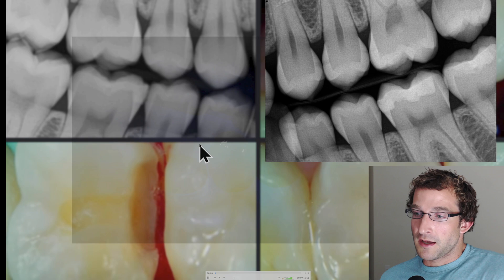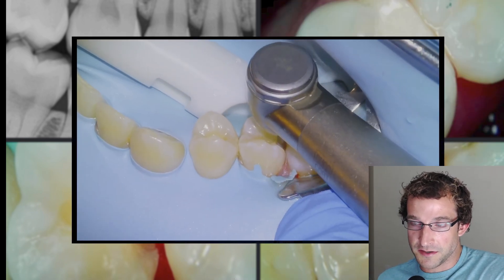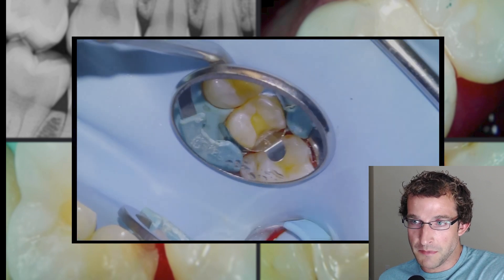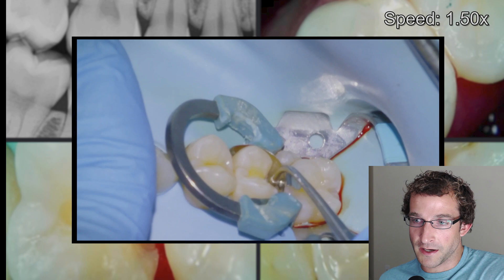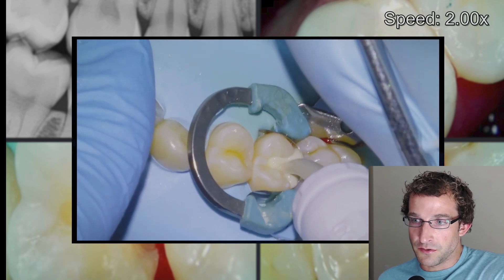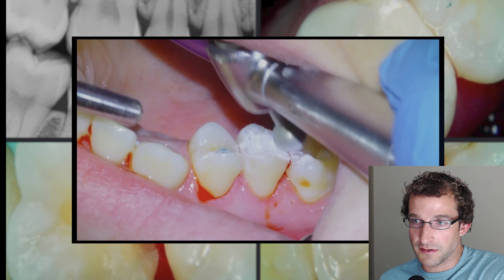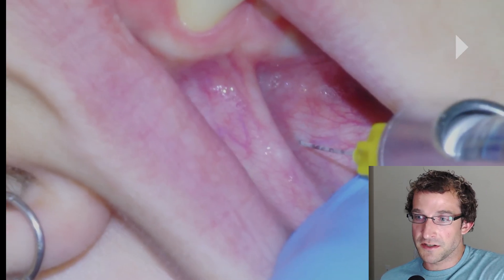So that's for the procedural footage — super routine, bread and butter restoration. I'm going to do an occlusal dovetail slot prep, matrix with a sectional band, then restore with Equia Forte. We'll get into the full footage here, finish off with a round diamond, and send the patient home. For the full footage, we're going to start with anesthesia.